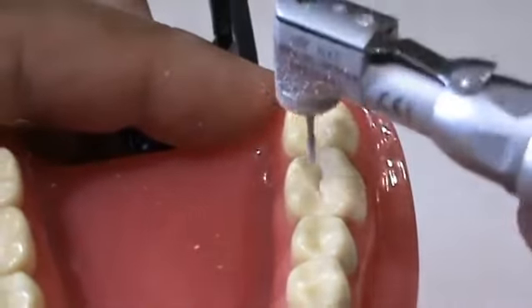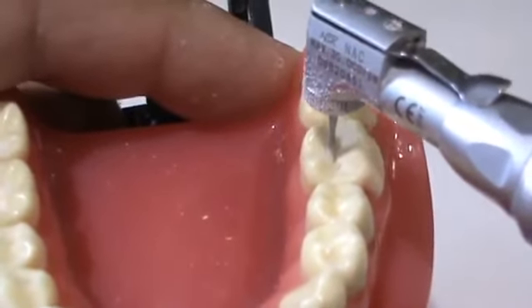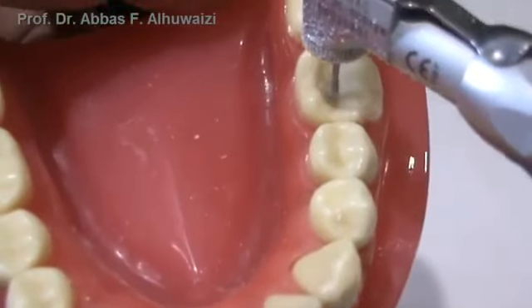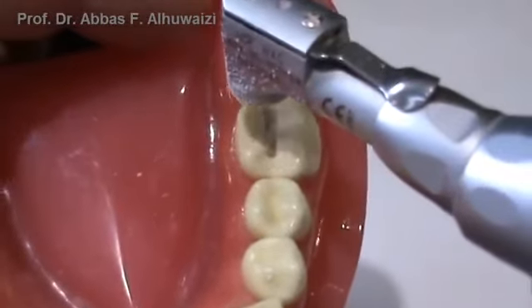Both the buccal and the lingual cusps. Also, care must be taken not to deepen the pulpal floor.